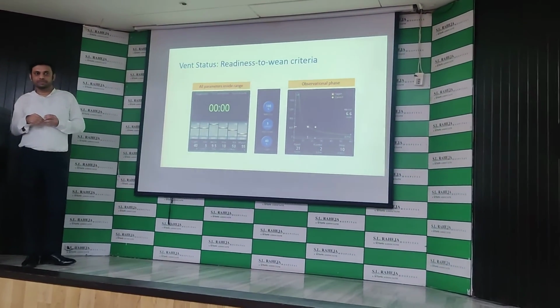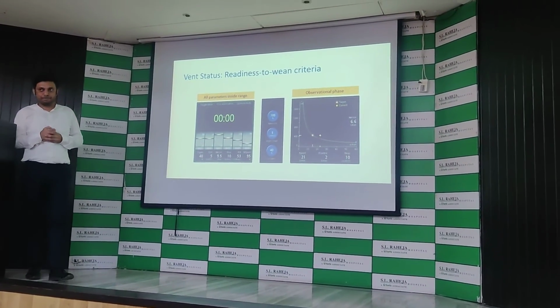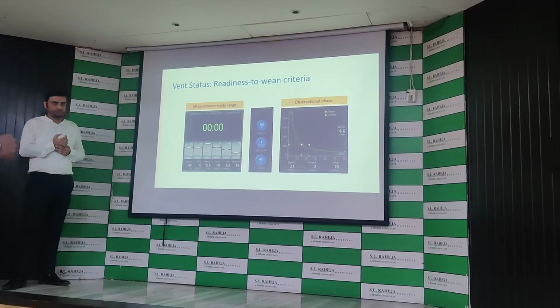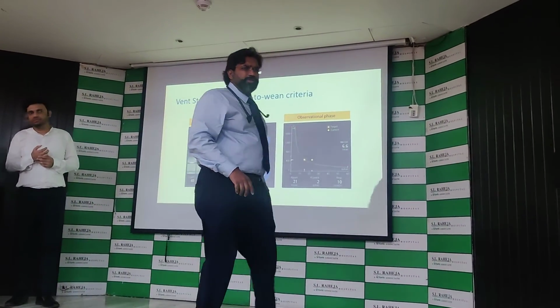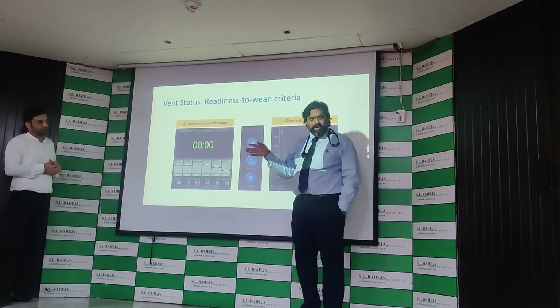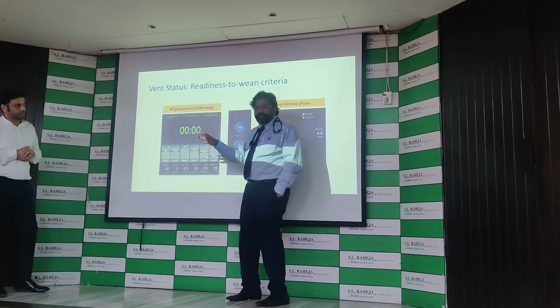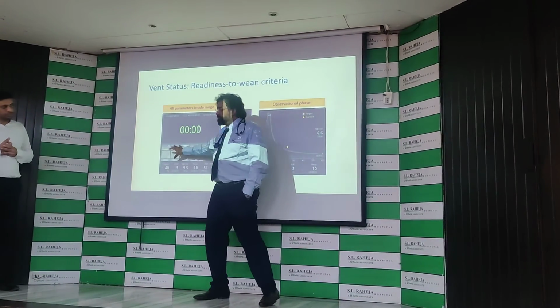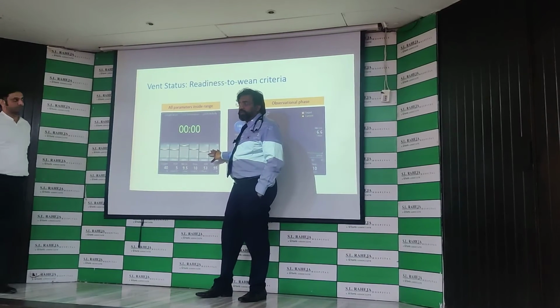As far as I found, the Hamilton G5 also has a very similar model, though the graphics were different. When this comes into this bar and all of these remain adequate, how do they calculate this adequacy?